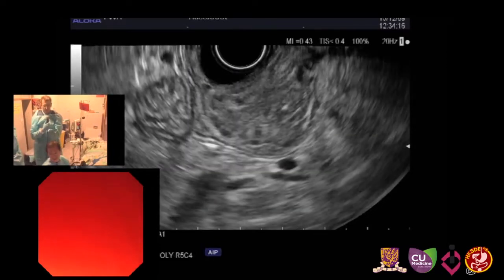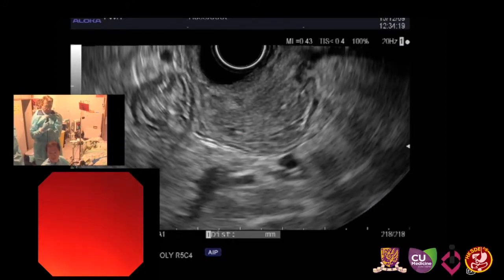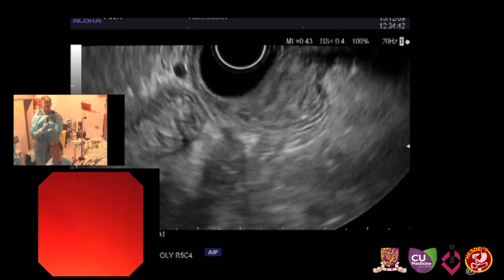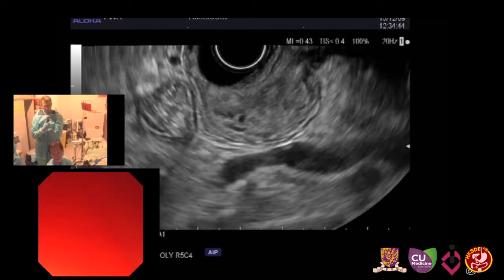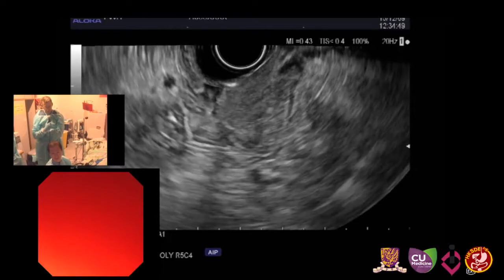Do you think intraductal ultrasound helps further? Yeah, EUS definitely helps, but I mean intraductal ultrasound. No. Okay. Just a careful cholangiogram at the time of the ampullectomy is also very helpful, because we look for shouldering or other features, but probably just looking at what I saw endoscopically briefly, I think it's a benign lesion. And in our favour, there's no gross biliary dilatation, and also he hasn't been jaundiced.